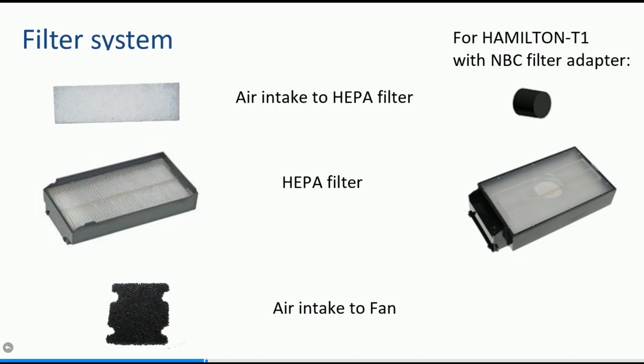The air intake filter mounted in front of the fan blocks dust from entering the device. The Hamilton T1 military version has a different HEPA and dust filter to those shown here. The air dust filters must be checked, cleaned or replaced frequently as described in the operator's manual or according to the hospital's protocol. All the filters must be replaced during the annual preventive maintenance.